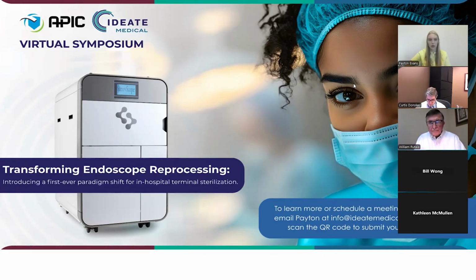Doe added, are there any adherences to manufacturer IFUs? Currently, go ahead, Bill. Currently, as it's very similar to a previous question, we are working with key MDMs to get our device onto their IFUs. Obviously, that's a long process, but I think AAMI ST58 basically allows us to support use of our system with your devices per our validation testing.